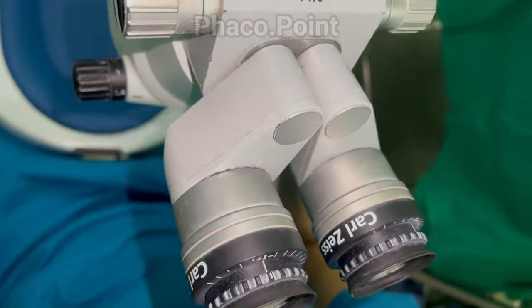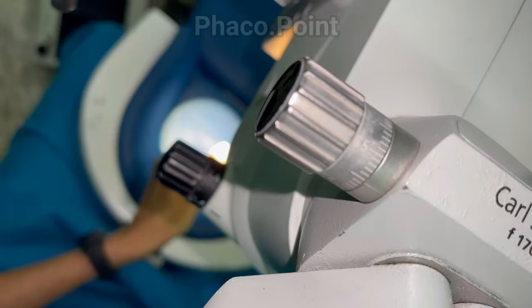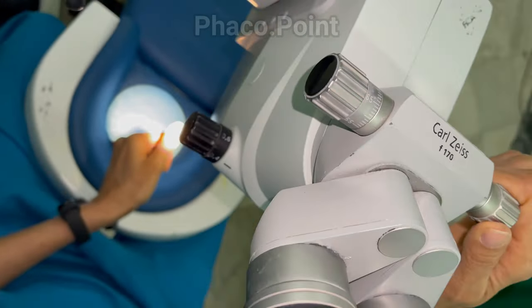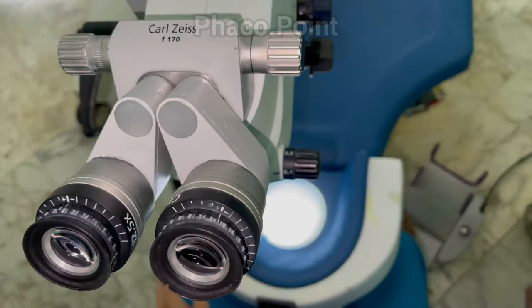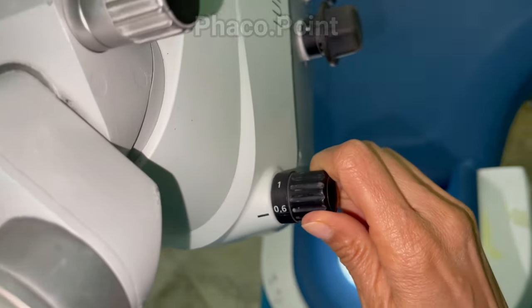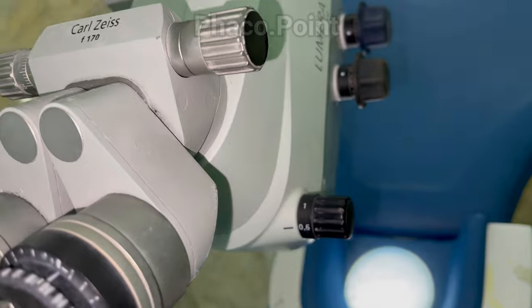Having achieved alignment of the oculars, the surgeon then adjusts the IPD — the microscope is turned on, magnification is reduced, and the surgeon focuses on a particular object and fine-tunes the inter-pupillary distance to achieve a single, uniform, comfortable view of the operating field. Finally, the surgeon chooses their preferred magnification — for me, that is 0.6. Ideally, all these settings should be configured before the surgeon scrubs up.